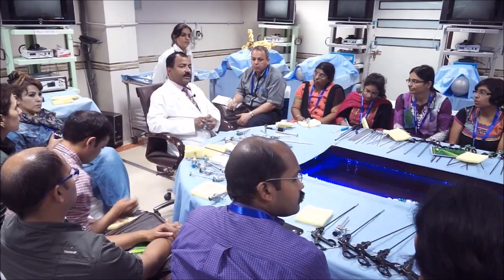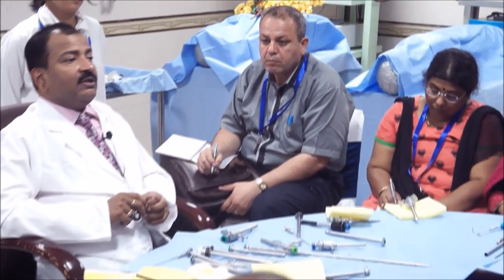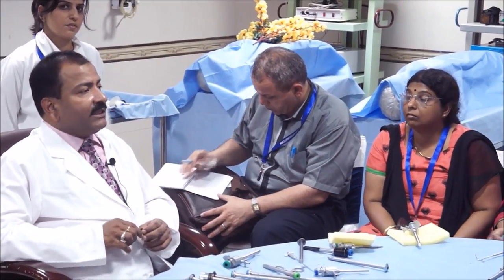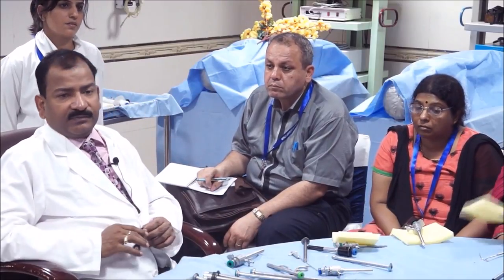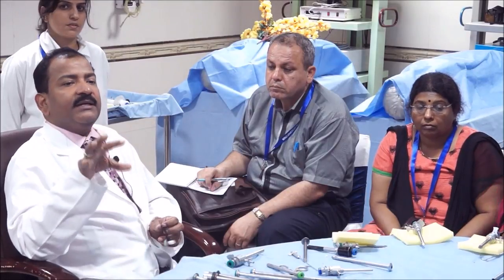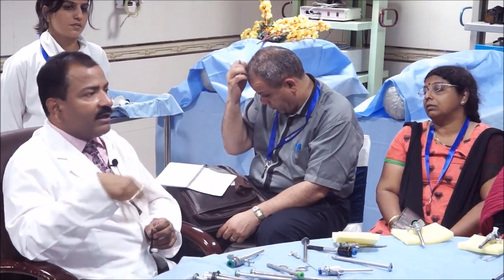If you want to explore the bowel, then 3 ports may be required, and minimum 2. So the definition of diagnostic laparoscopy is a visual examination and interpretation of the intra-abdominal organs in order to detect any pathology by 2 ports. If you are using only a single port, like the telescope only, then it is called peritoneoscopy. It means you are just seeing the peritoneal cavity.